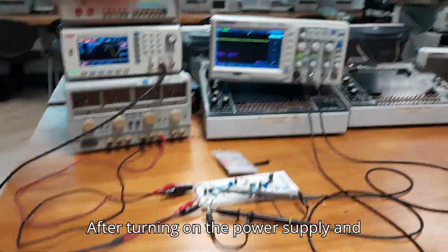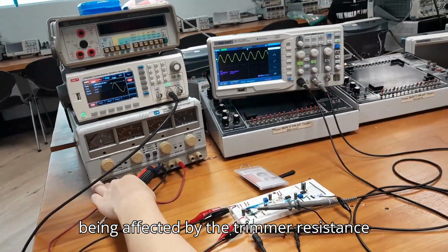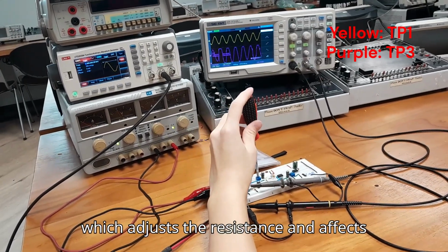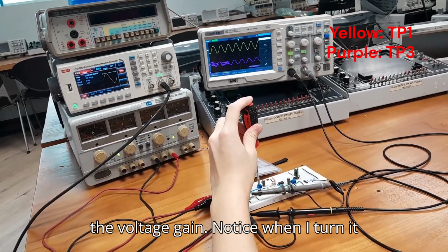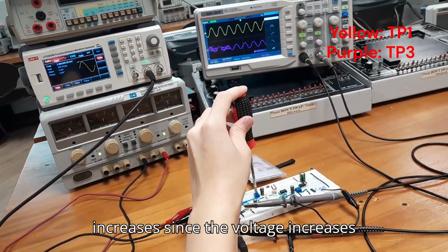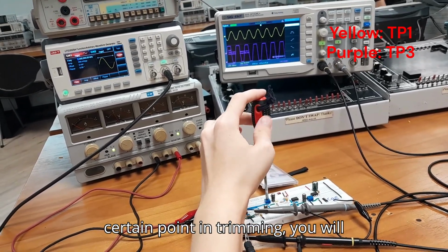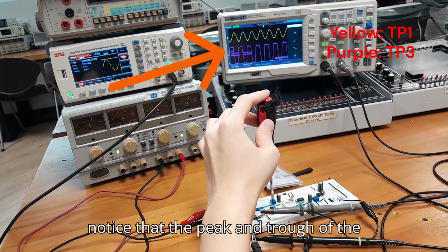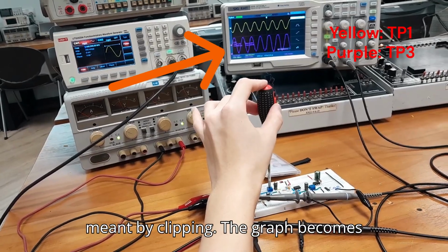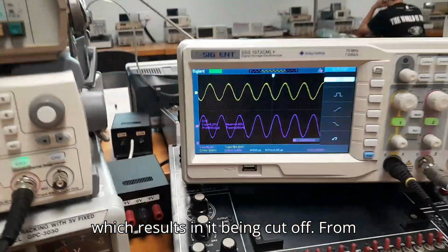After turning on the power supply and function generator, you can then see on the oscilloscope how the waveform is being affected by the trimmer resistance, since I am adjusting the screwdriver which adjusts the resistance and affects the voltage gain. Notice when I turn it clockwise, the amplitude of the graph increases, since the voltage increases with increasing resistance. After a certain point in trimming, you will notice that the peak and trough of the waveform begin to flatten. This is what I meant by clipping. The graph becomes saturated after a certain voltage gain, which results in it being cut off.